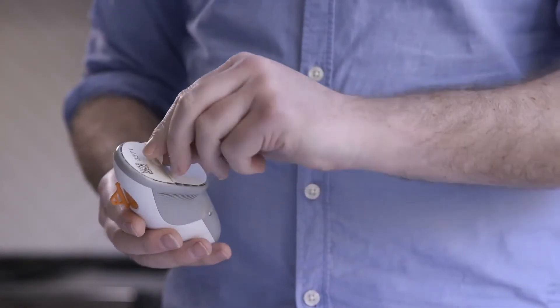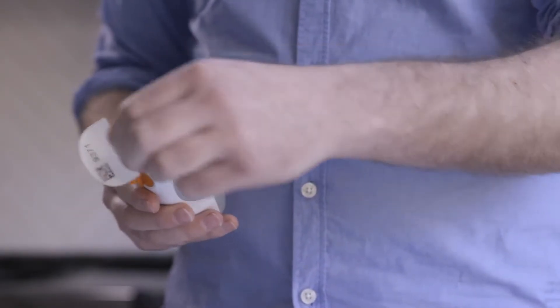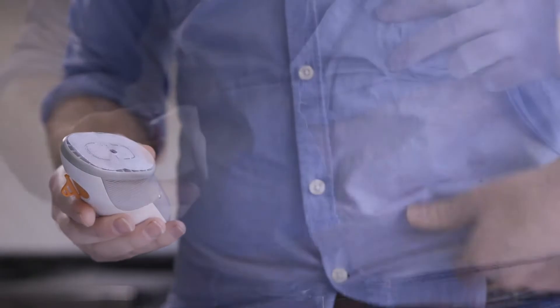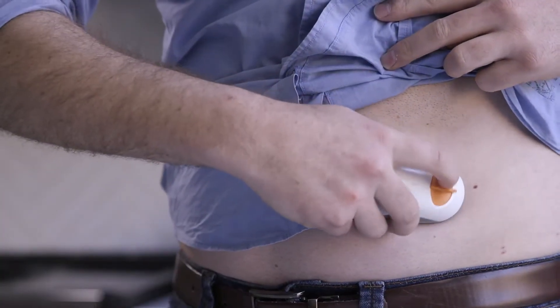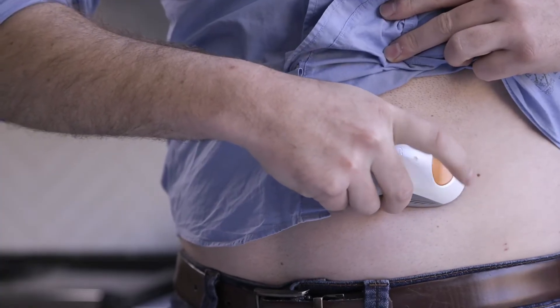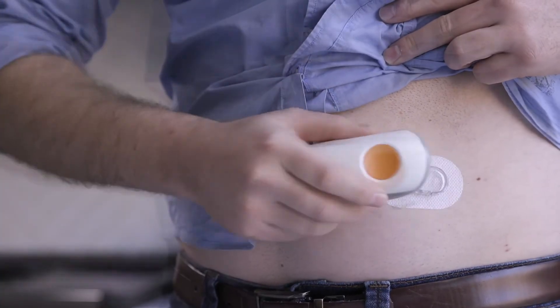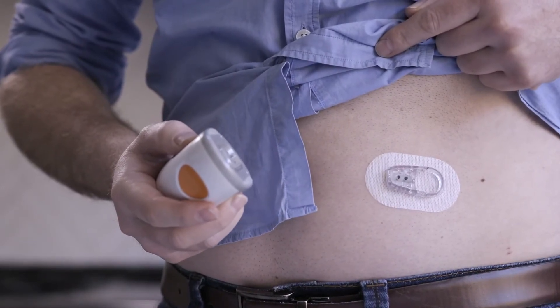Peel off the adhesive backing. Place the applicator on your skin. Fold and break off the safety guard. Press the button to insert the sensor. Remove the applicator. You have now successfully inserted your sensor.